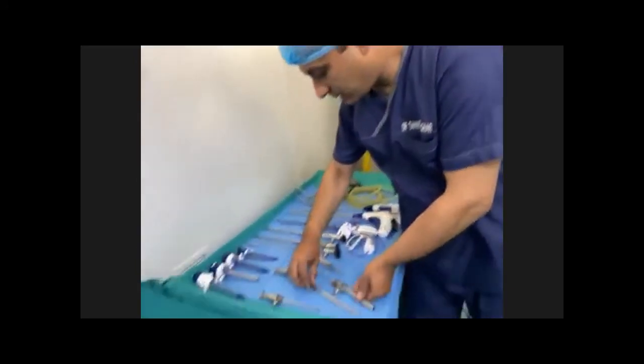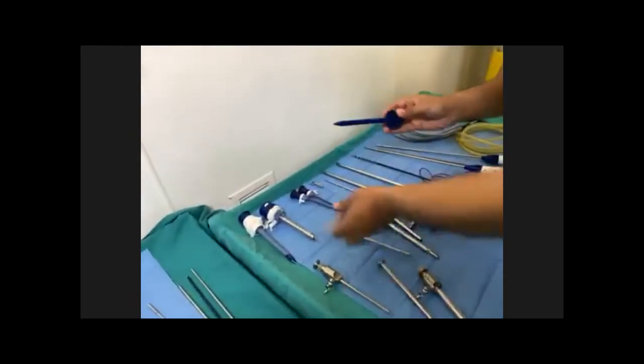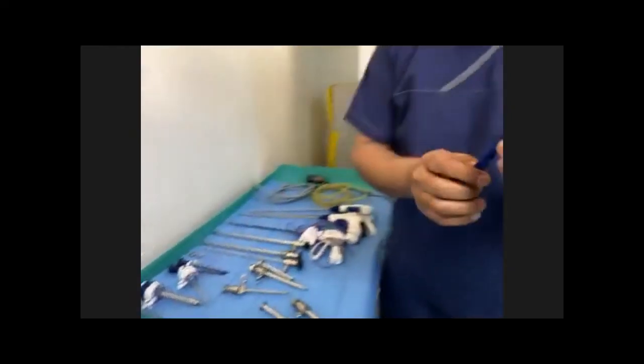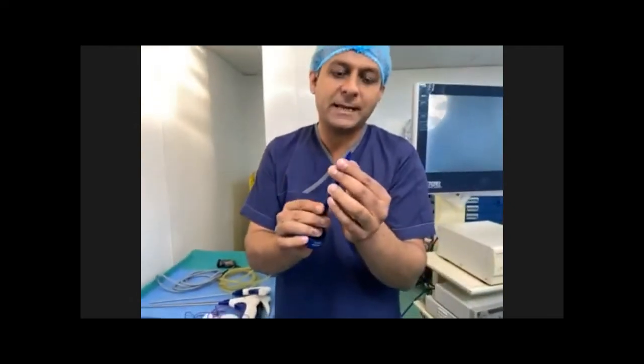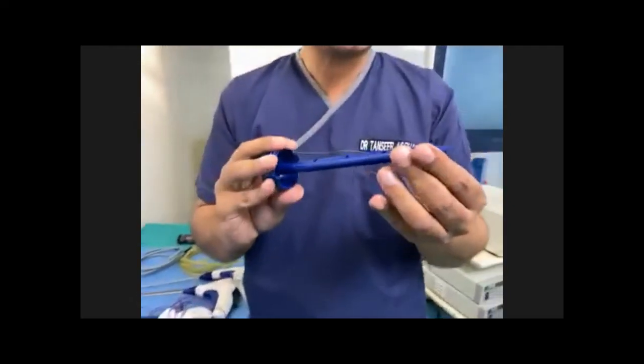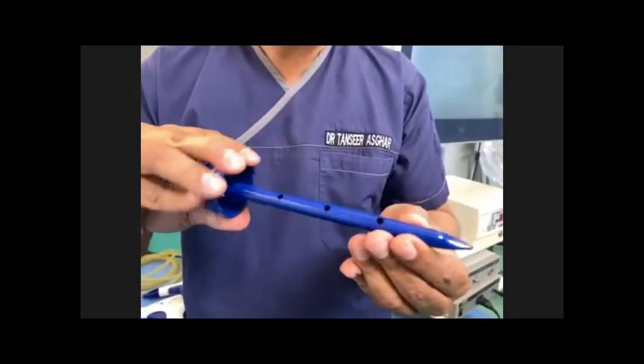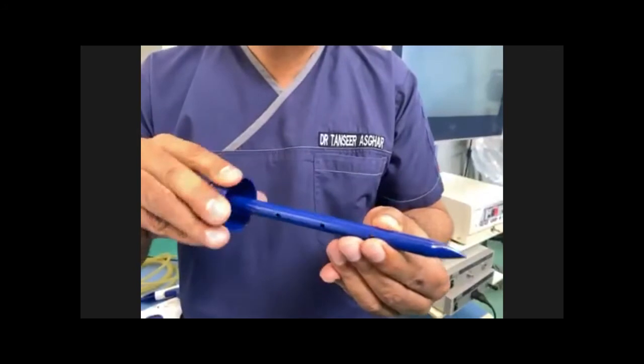There are other types of trocar as well, like this one. This has an end which is called a pyramid end. It looks like a pyramid. The superiority of this trocar is that when you go in, cutting in the abdominal wall, it gives more space and it splits the muscles well.